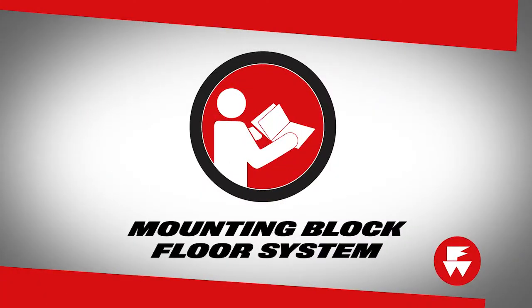Directions on installing the FERNO mounting block floor system for STAT-TRAC and inline fastening systems can be found in the mounting block floor system user's manual.